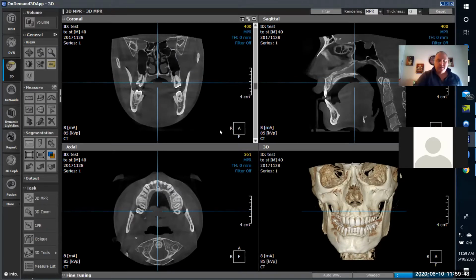This will be a series intended to help current users with their HDXWILL CBCT learn how to get the most out of their CBCT with the on-demand software. During these web discussions, if there are additional topics that you want covered, please let me know.